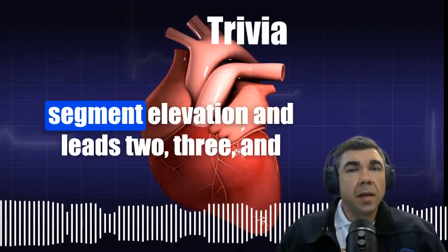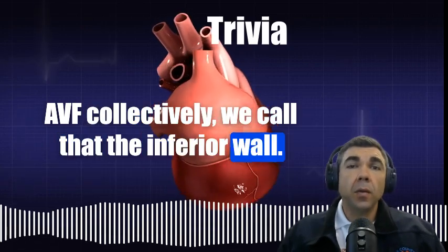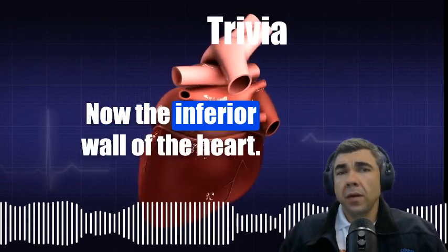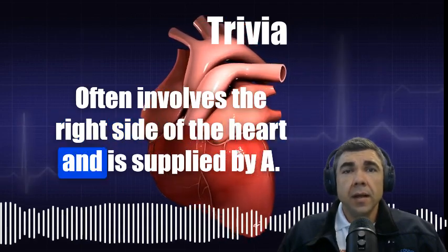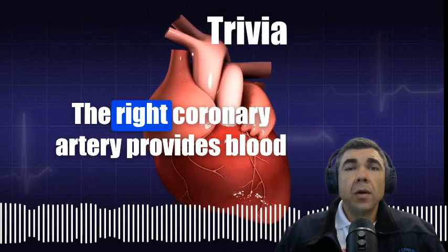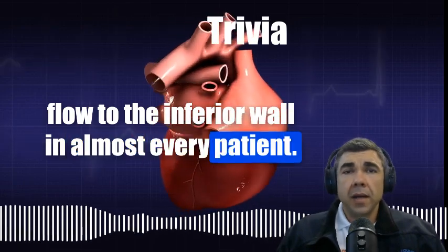Now we're looking at ST segment elevation in leads 2, 3, and AVF. Collectively, we call that the inferior wall. It's viewing the inferior wall of the heart. Now, the inferior wall of the heart often involves the right side of the heart and is supplied by A, the right coronary artery. The right coronary artery provides blood flow to that inferior wall in almost every patient.